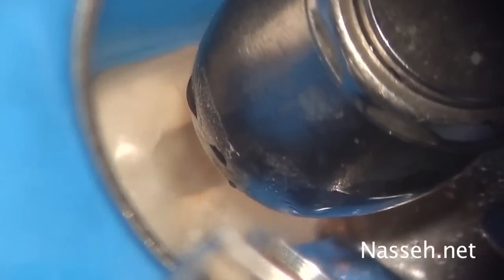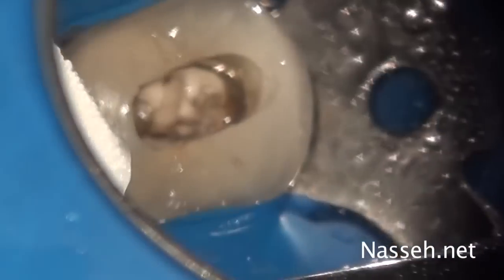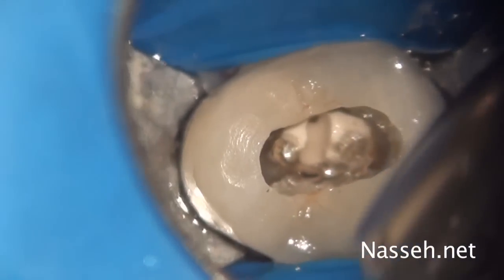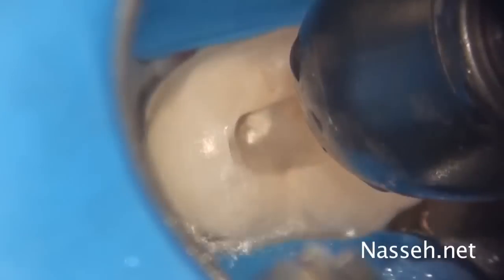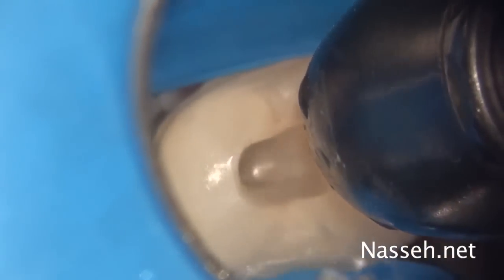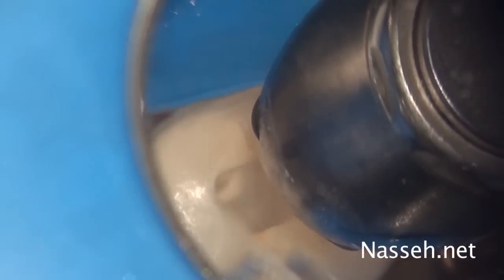a small pear-shaped fissure burr was used to cut the core around the silver points. Having a very steady hand is really useful here, as the smallest move will nick the silver points.